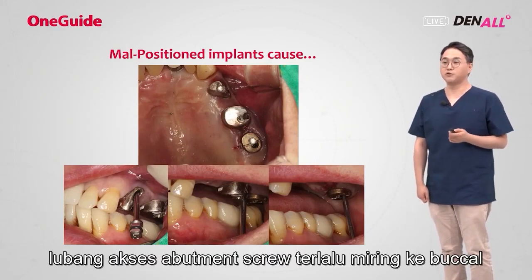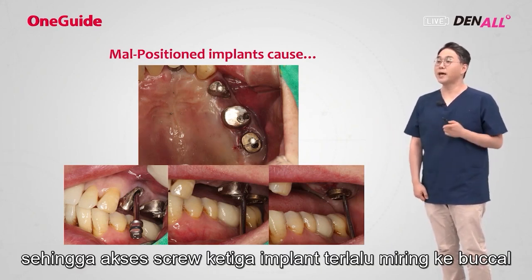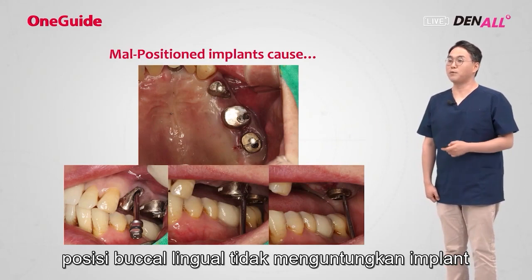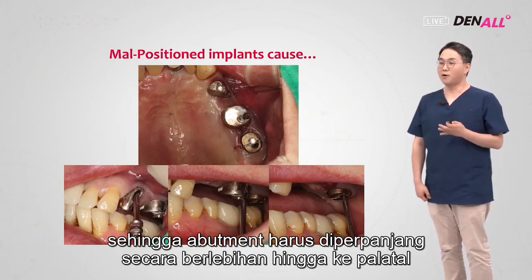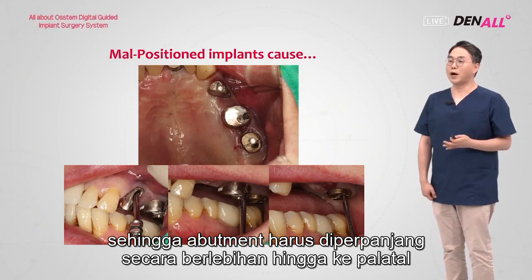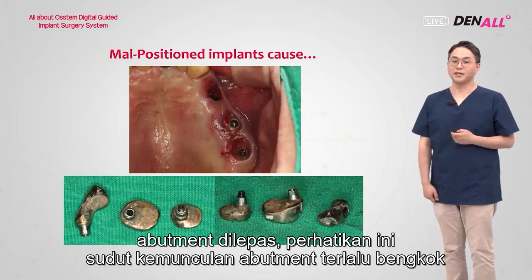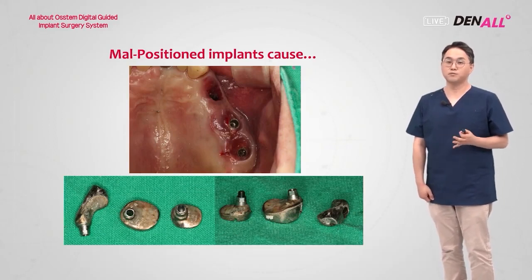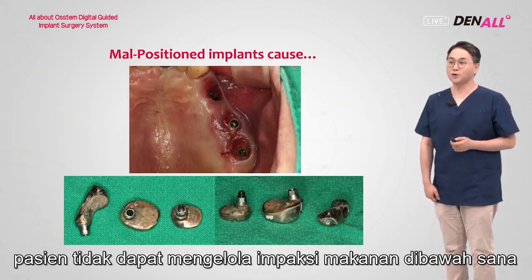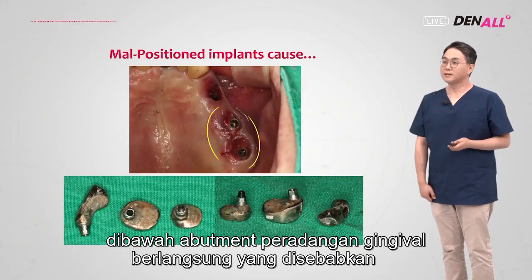The abutment screw access hole was too buccally inclined, so in all 3 implants, the screw access hole was buccally inclined. Buccolingual position was very unfavorable. The implant was buccally inclined, so the abutment had to be excessively extended towards the palatal. So the abutment was removed. Take a look at this. The abutment emergence angle was excessively bent. The patient was not able to manage food impaction below there. Below the abutment, continuous gingival inflammation was caused.